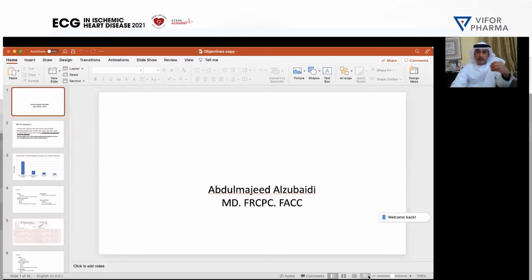What are the criteria to diagnose a STEMI? What are atypical criteria? What's a posterior MI? What's an RV infarction, and so on and so forth. So specific messages related to acute myocardial infarction.